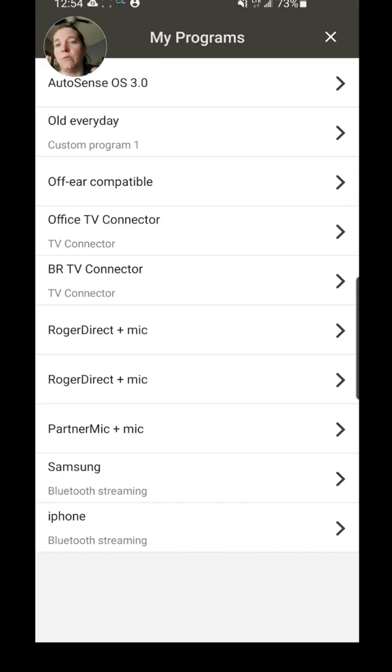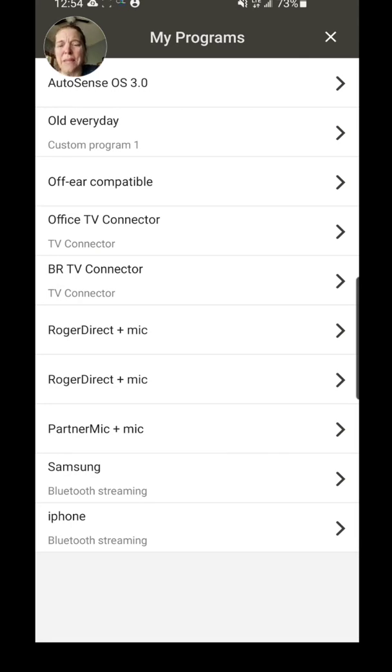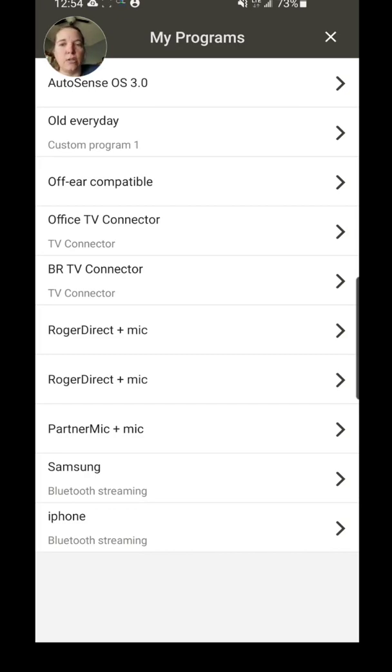Because I have my processors connected to my iPhone and I have my processors connected to my Samsung phone, this just allows me to see in an instant what I'm connected to. Not such a big deal because on the Bluetooth you really know what you're connected to—it's not like you can connect to something unknowingly.